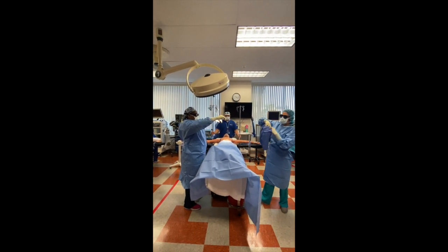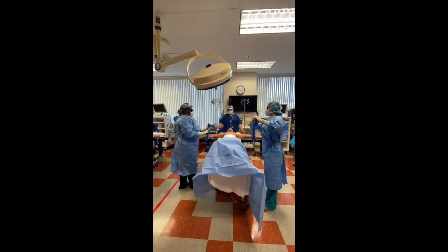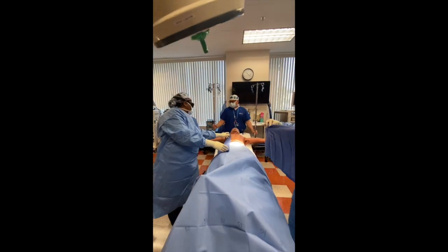Whoa, I'm being sabotaged. Sorry, doctor. Give me a second — I've got to get my life together over here. Just be aware of that armboard, please. You're very close. Thanks, doctor.